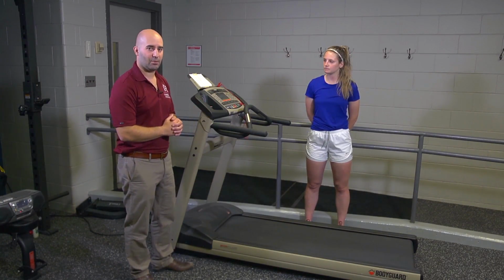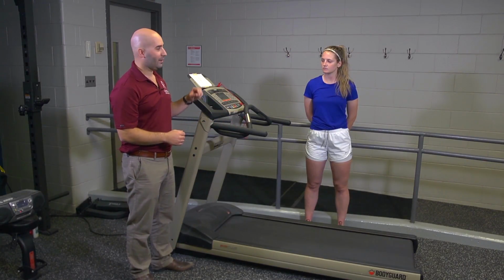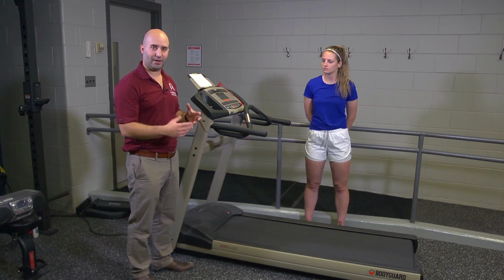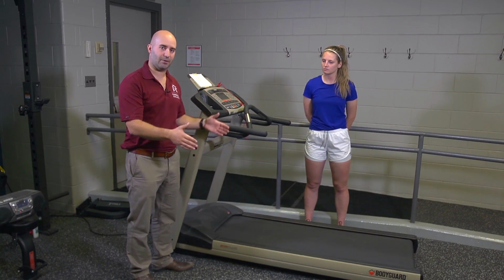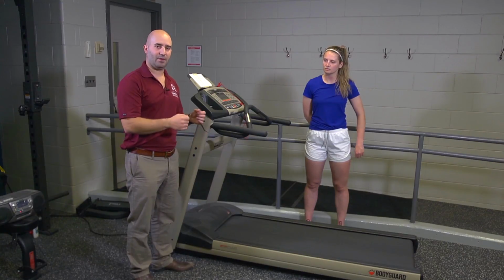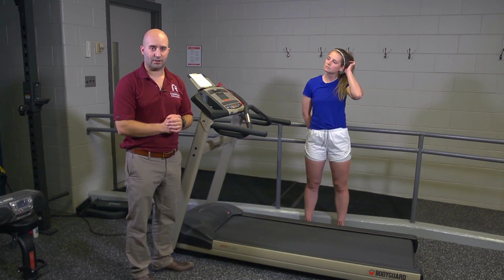The other thing that's unique about this test is that it uses the treadmill, and with it, because Clara will be walking and moving, I won't be able to do palpation. There's no stages where she'll actually be stepping off the treadmill. And so that makes it quite harder. And because of the sound of the motor, it can be quite hard to use auscultation.